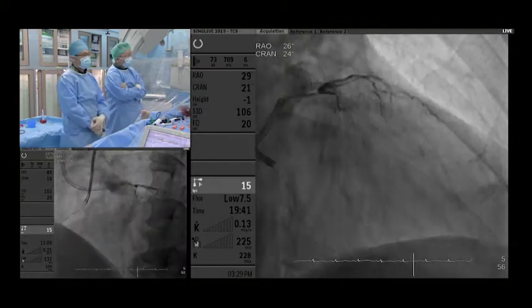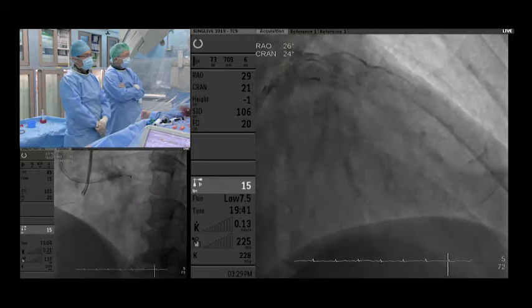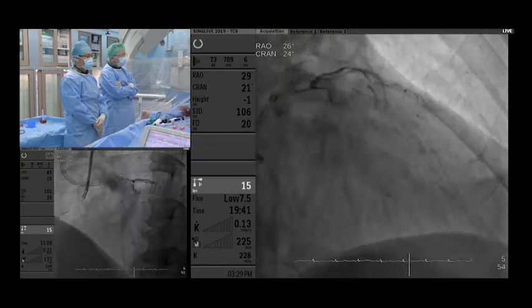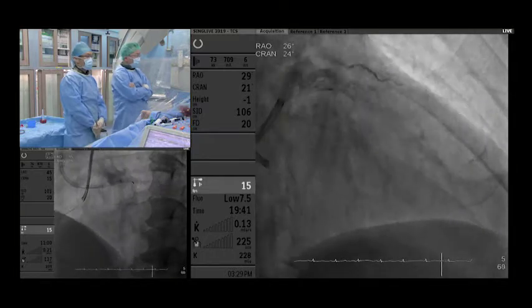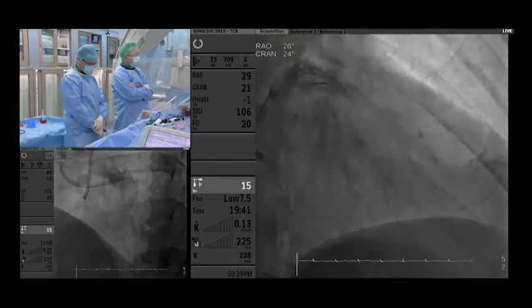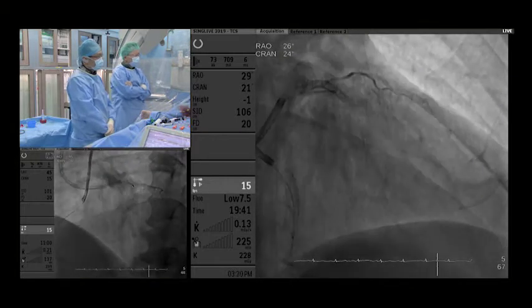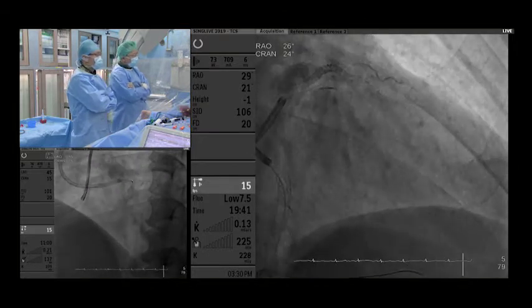Thank you so much. I think, of course, we can find the severe calcified portion in the CTO body. So, of course, we should use a harder type wire than Gaia 2 or Gaia Next 2 at first. But I think maybe Gaia 2 cannot work at the calcium part because this calcium part may be more than about 10 millimeters from the CT angiogram. So maybe we use a parallel wire technique with a much harder wire or, of course, retrogradely. At first I can see the good collateral channel from the septal.